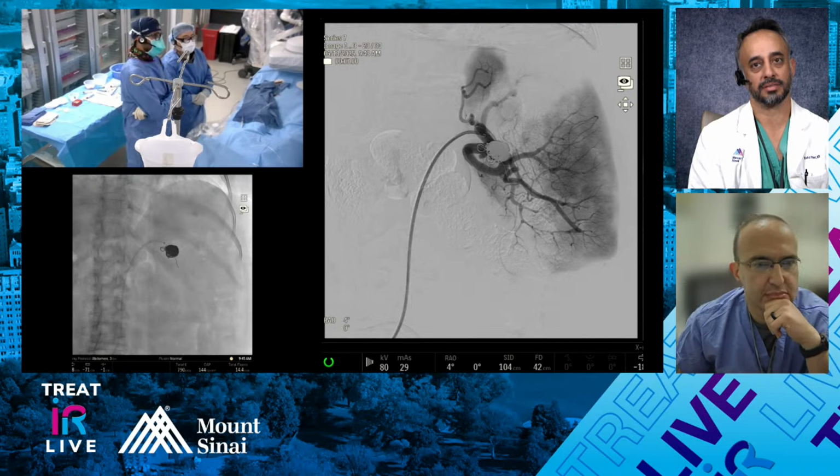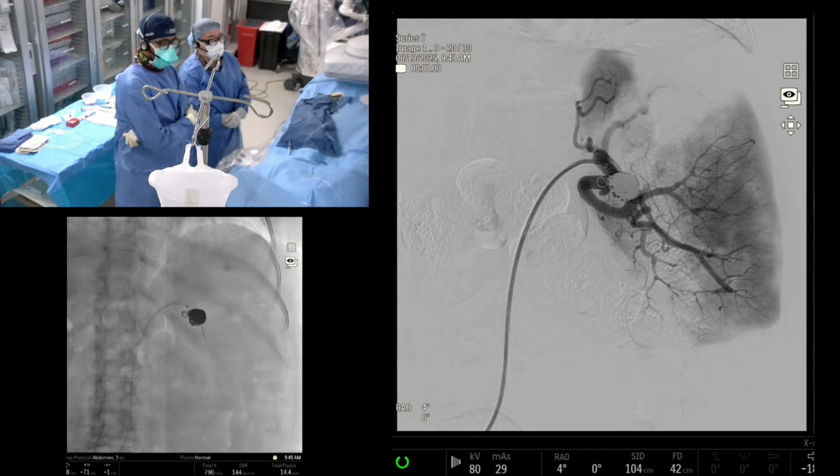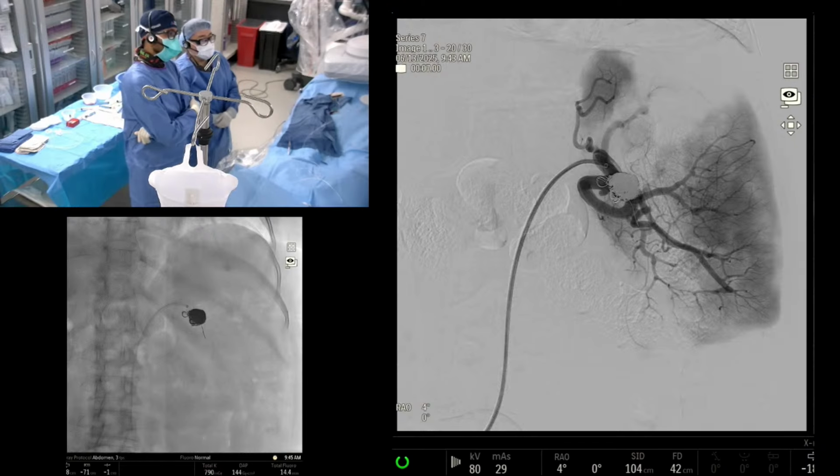There is, as you said, malperfusion here, but just when you think, oh my God, and you tell the patient afterwards when they wake up, hey, next couple of weeks you might feel a lot of pain, this and that, some of them do, but some of them come back and are like, no, it's totally fine. You do the MRI, and somehow collaterals, even this distally, have opened up and created perfusion. Now, in her case, it's not a bad thing if some of this actually does undergo ischemia infarct, because it might help her a little bit with her portal hypertension as well. So she's got a lot of spleen to give, and so I'm okay with this.